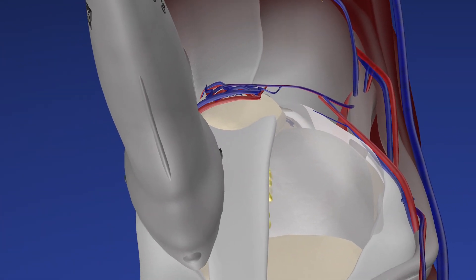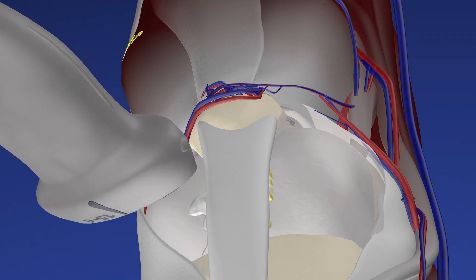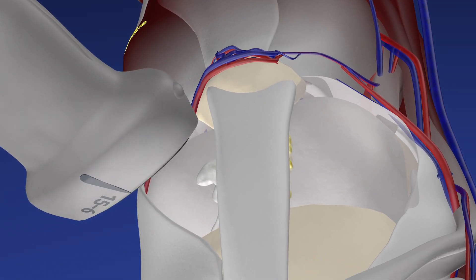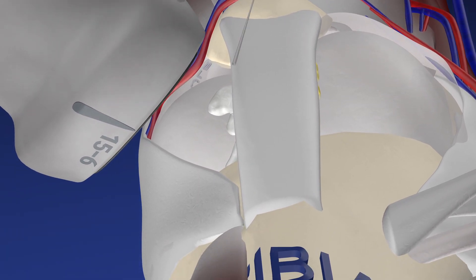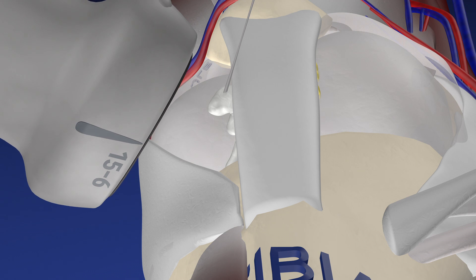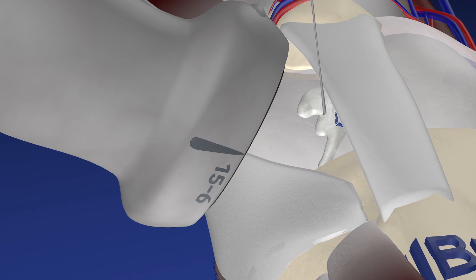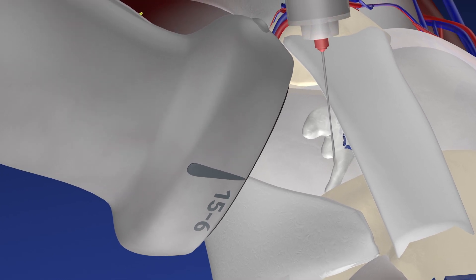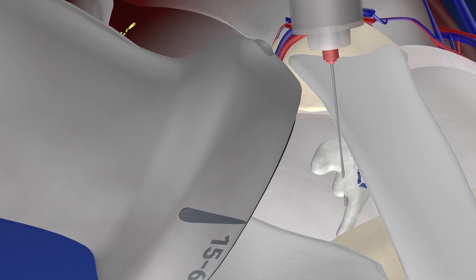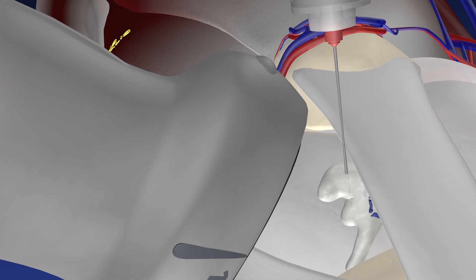We actually went in a second time through a different part of the ganglion. This time we had the probe in an axial view on the lateral, or anterior lateral, aspect of the knee. We're almost going directly perpendicular to the skin with the needle, so we tried to rotate our probe more lateral to have it parallel to the needle. During this second attempt, we redirected the needle into this communication track to help try to break it up — something you can really only do with ultrasound guidance.